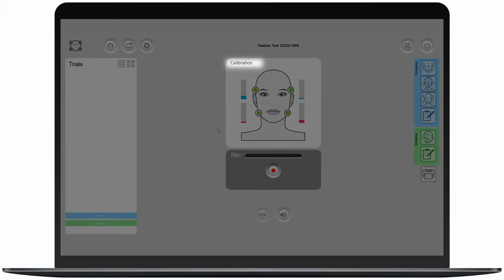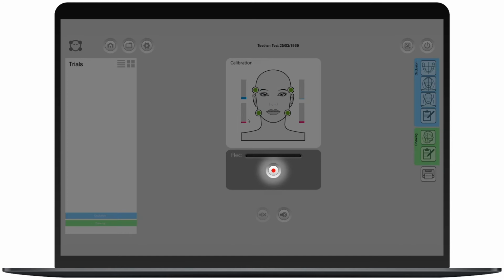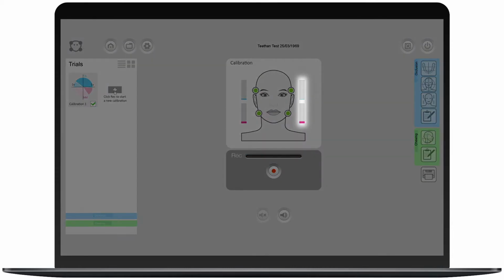The first test is the calibration test. For the calibration test, place 2 cotton rolls between the dental arches on the 5th and 6th teeth, 2nd premolar and 1st molar. Ask the patient to perform a continuous maximal clench on the cotton rolls and click the record button only after the patient has started to clench. After 5 seconds, the recording stops automatically and the patient can then relax. The bars indicate the electrical activities of the muscles analysed.